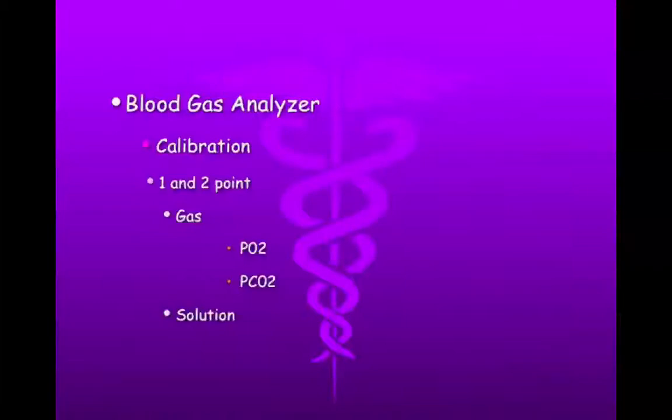Solutions that go across as they're analyzing, as they're calibrating to test their calibrations, also occur inside a blood gas machine. Blood gas machines are getting pretty darn sophisticated. A lot of the work that we used to have to do as respiratory therapists to make sure that they stayed calibrated, that they got the 1 point cal, they had the 2 point cal, that they calibrated and came in, and there was no drifting that went on, and that the quality controls are all within the right range, has come so sophisticated that really, as an RT, a lot of times you don't have to do a lot. The machine does most of the work for you.